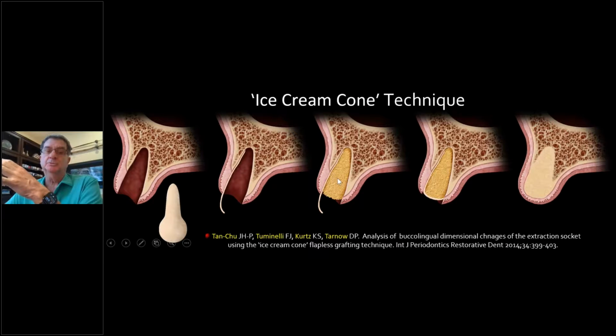So I came up with the ice cream cone technique, where I put the implant, I took a piece of collagen membrane, and you've got to use a thick collagen membrane, one that does not collapse when it gets wet. So it's got to be thick when it gets wet, so it doesn't just collapse on itself. Like BioGuide, you can't use. So you've got to have one that's thick. BioHorizons has one now that's thicker. Use that, shape it like an upside down ice cream cone.